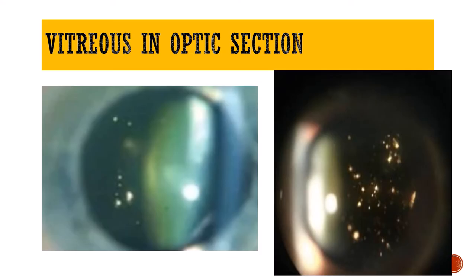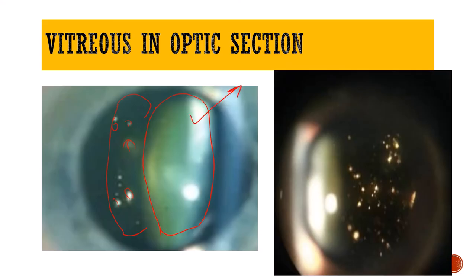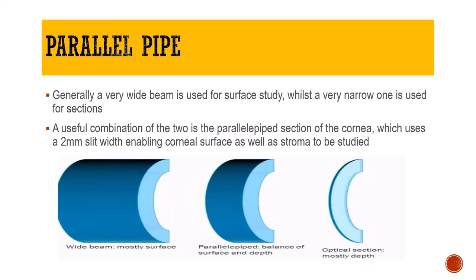The optical section can also give information about the vitreous, specifically the anterior part. To focus on the anterior vitreous, move the joystick even further inside toward the patient. You will see a section behind the lens — that is the vitreous — and you can see opacities in the anterior vitreous. When focusing on the cornea, the lens may not be clear; when taking an optical section of the lens, the vitreous may not be clear — you focus directly on one structure at a time. These refractile glistening particles in the vitreous represent asteroid hyalosis.